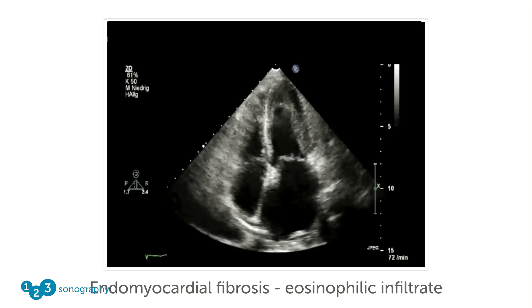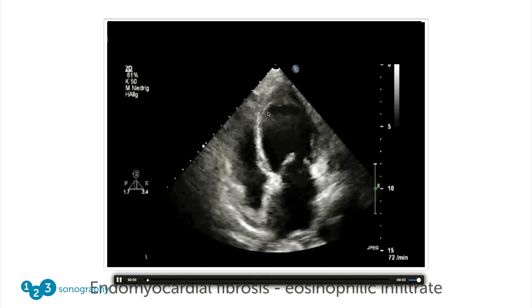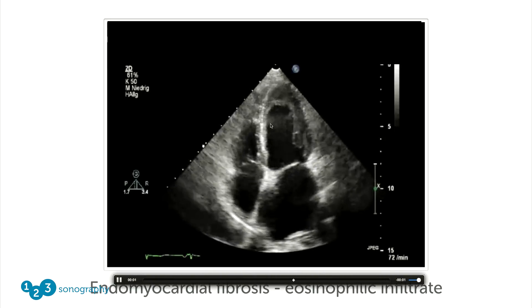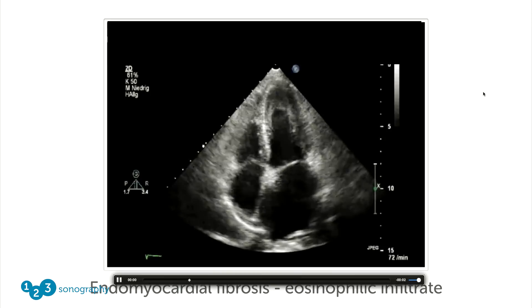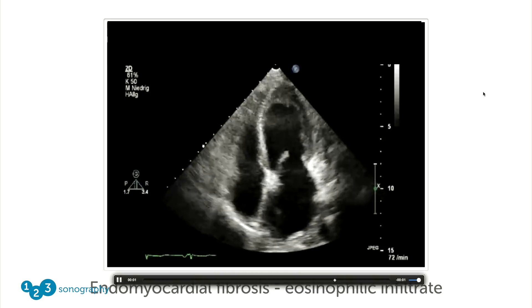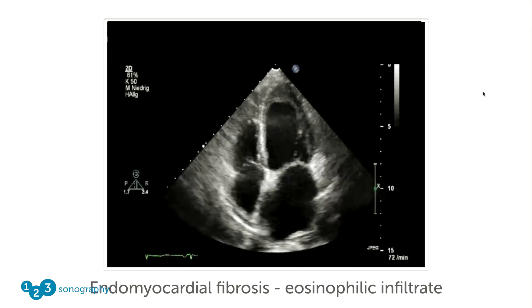Finally, here's another pathology that might look like a thrombus. You again have a structure in the apical part of the four-chamber view, but there are no wall motion abnormalities — actually the ventricle appears hyperdynamic. What is this? It's endomyocardial fibrosis with an eosinophilic infiltrate — another differential diagnosis to a thrombus.